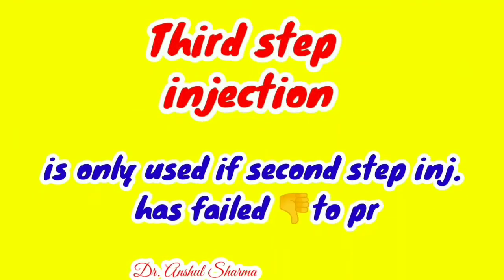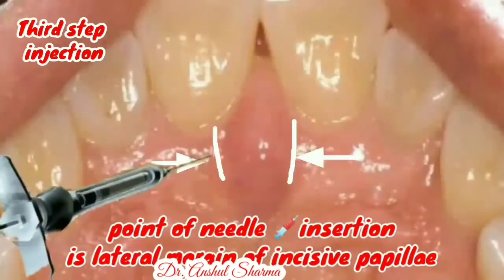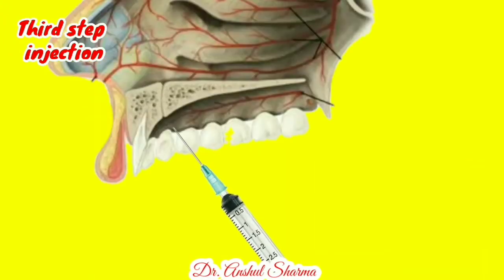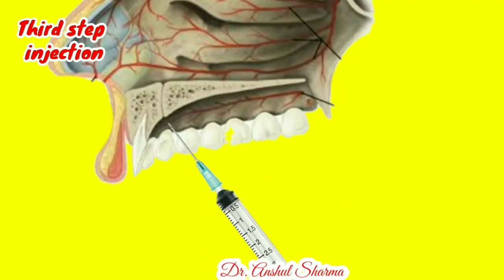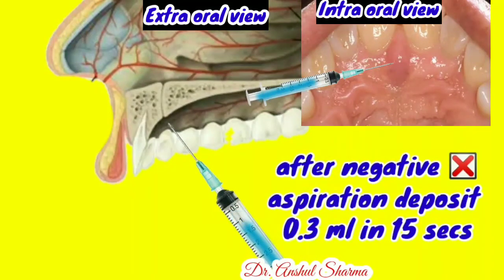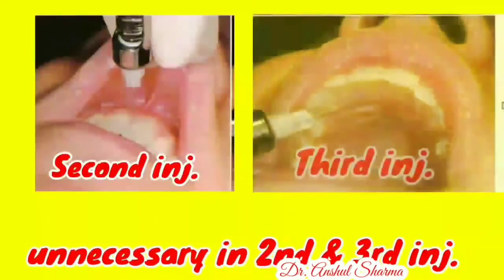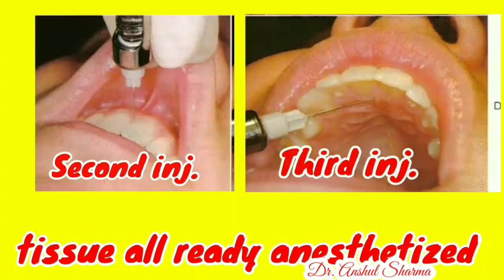The third injection is used only if the second injection has failed to provide adequate palatal anesthesia. The point of needle insertion is the lateral margin of the incisive papilla. Ask the patient to open the mouth wide and extend the neck. Advance the needle until contact is made with bone, then withdraw 1 mm to prevent a subperiosteal injection. After negative aspiration, slowly deposit not more than 0.3 ml of anesthetic in approximately 15 seconds. Note that topical and pressure anesthesia are unnecessary for the second and third injections, as tissues are already anesthetized by the preceding injections.